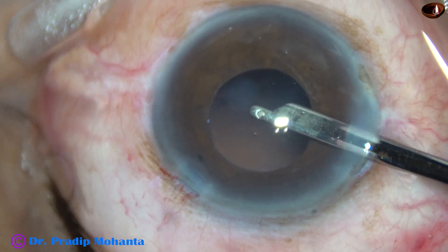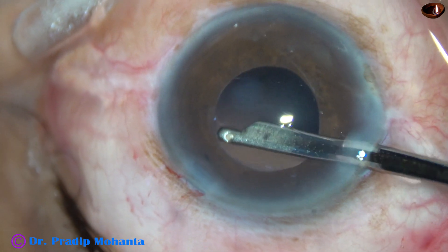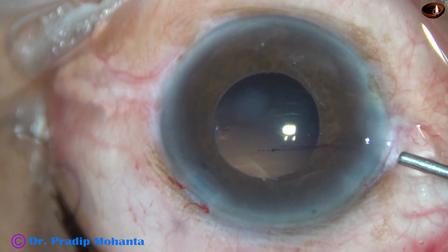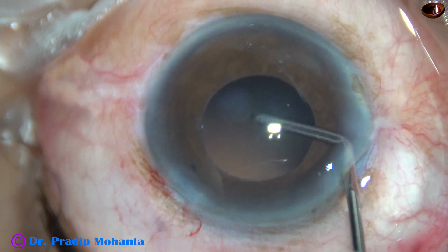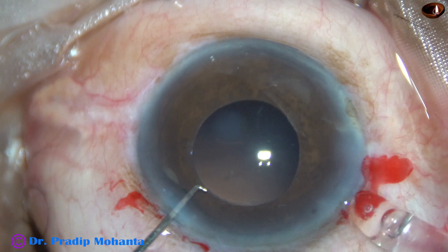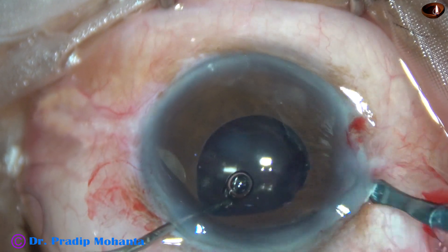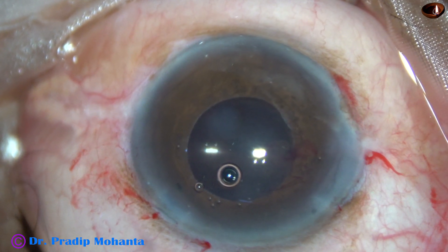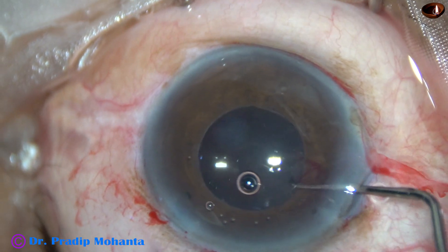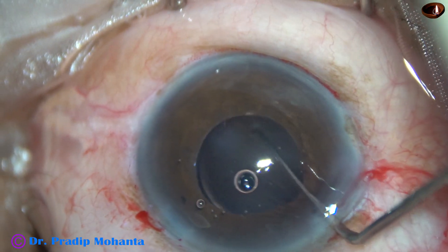In this case, I didn't use a capsular tension ring because I find that the anterior capsular rim is circular. So I inject viscoelastic, fill up the capsular bag as well as the anterior chamber, and then implant a single-piece monofocal intraocular lens in the capsular bag. Another option is to implant a multi-piece intraocular lens in the sulcus and do optic capture, because this lens-bag complex may drop into the vitreous cavity after several years.